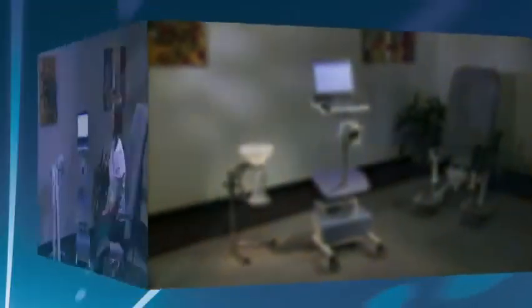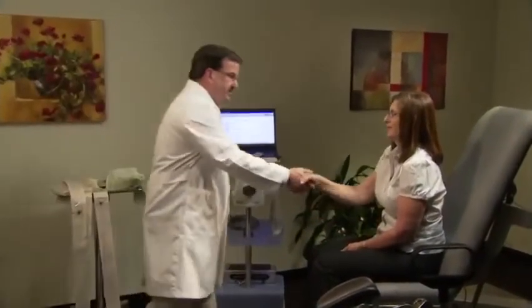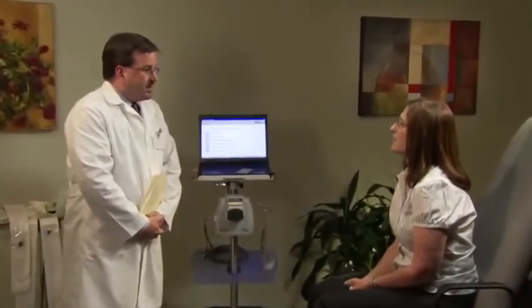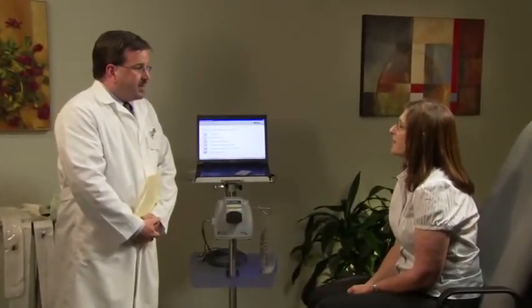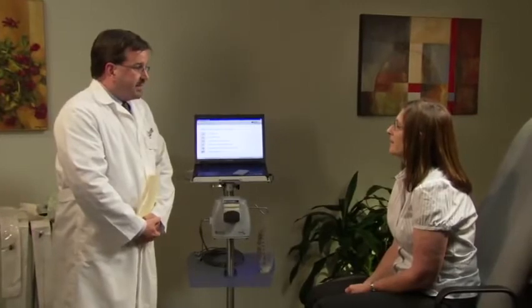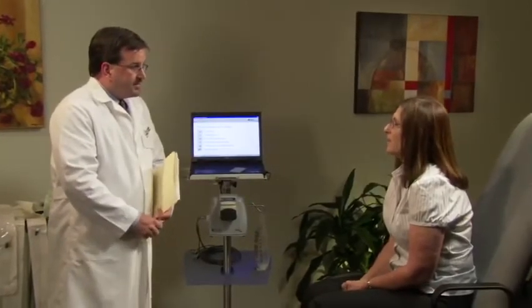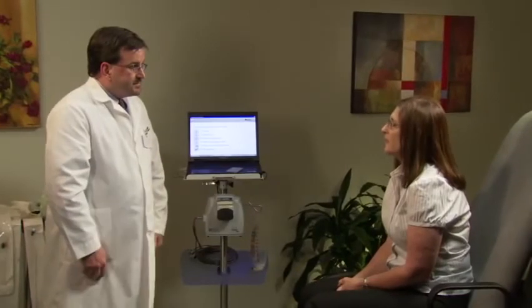You are now ready for your patient. The nurse greets the patient: "Hi Mrs. Jones, my name is Mike, I'm a nurse. I'm here today to perform your urodynamics study." The patient responds and the nurse asks her to describe her symptoms. She explains that for the last couple of years, every time she coughs and sneezes, she does leak.